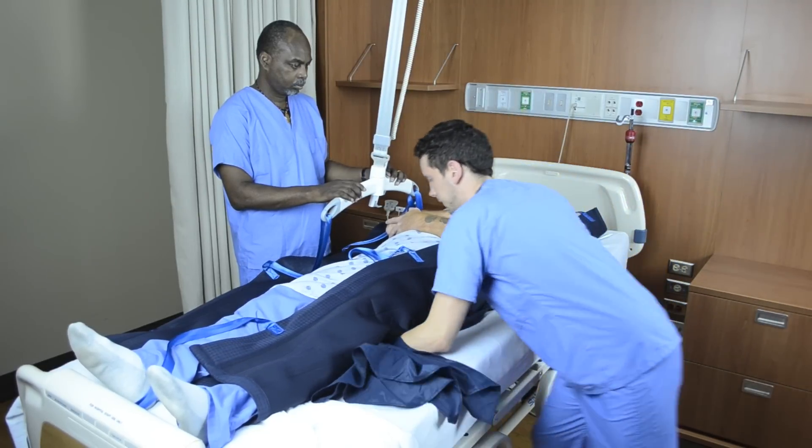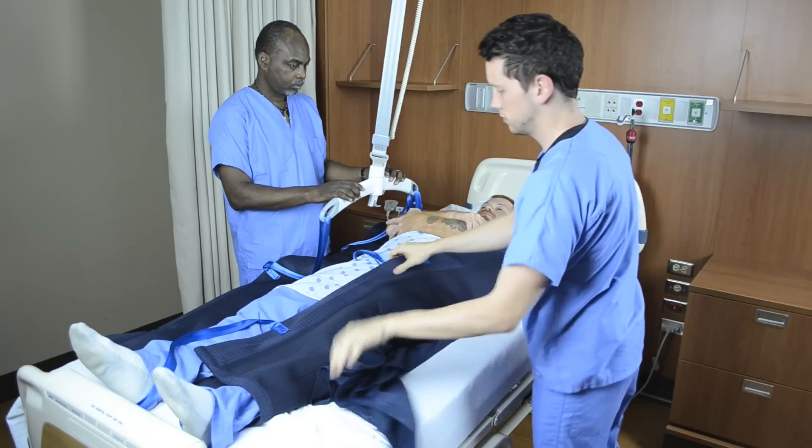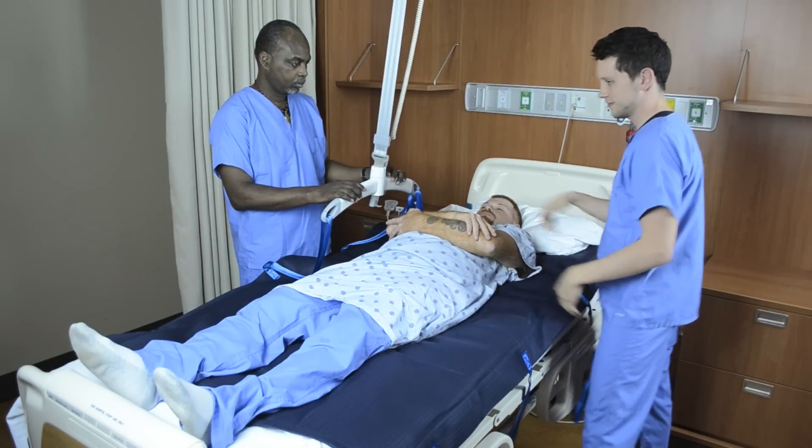Attach the straps on one side of the sling to the carry bar. Make sure all straps are secure on the carry bar lifting hooks.